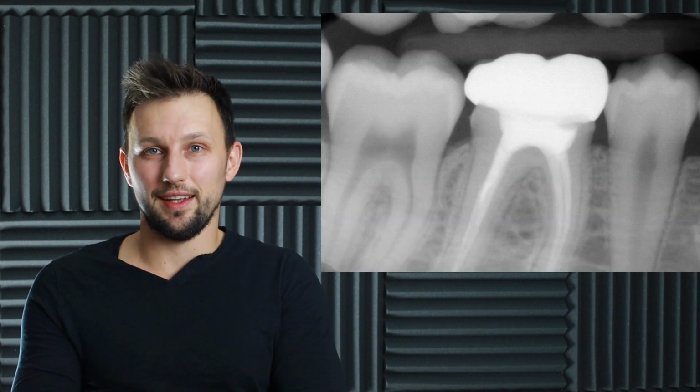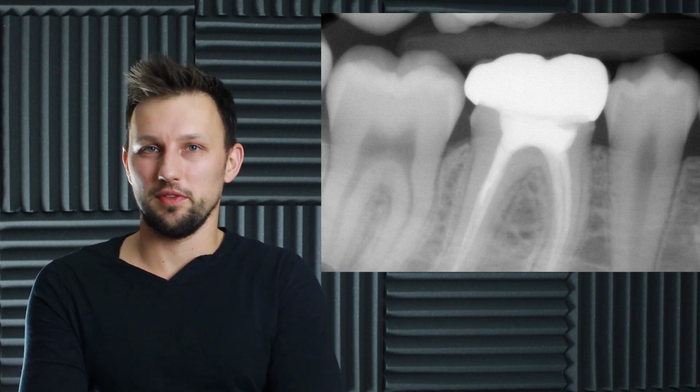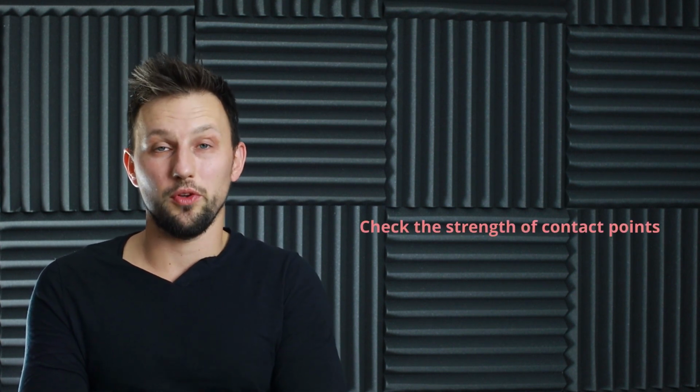And try to imagine what I had in my head when I took an X-ray after the cementation. The crown was completely out of the right position. So this is why it's so important, especially with vertical crowns, to check the contact point in a more objective way. I hope it was a useful trick for you.